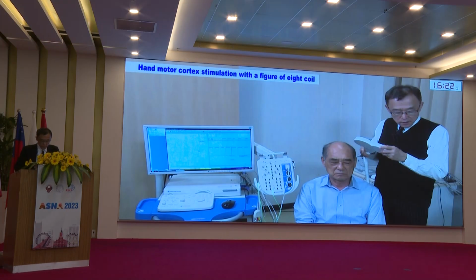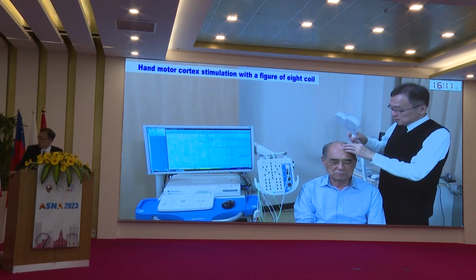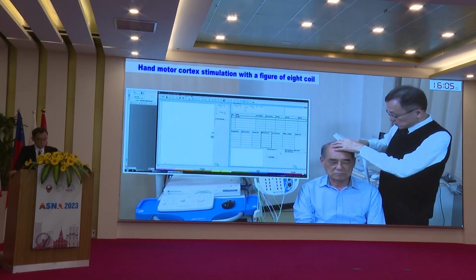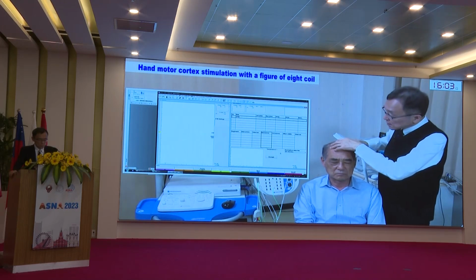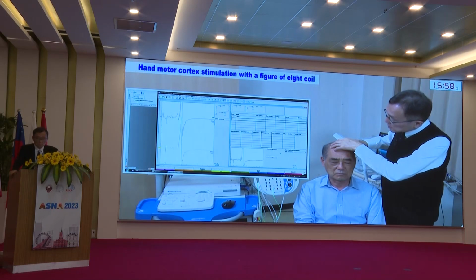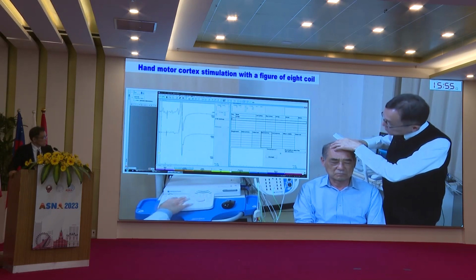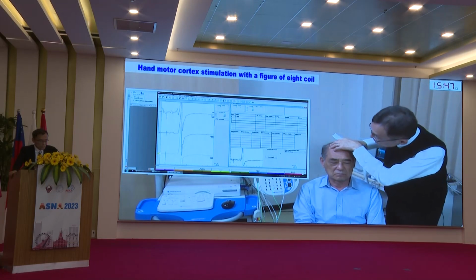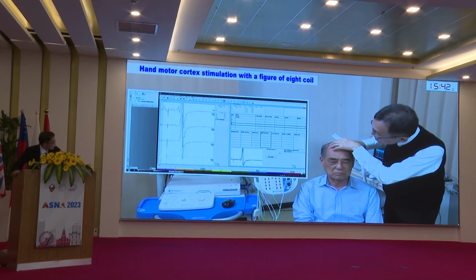And so I will show this. First I stimulate here at the motor hotspot, and the active condition is like this. You see the very large responses, and usually we record 2 or 3 times. At this time, 2 times, and now relax, please. So these were large responses; if relaxed, you see small responses, and 3 times we may take it.